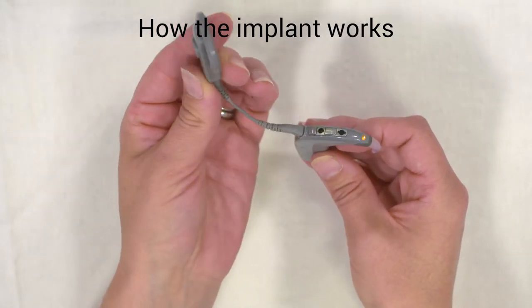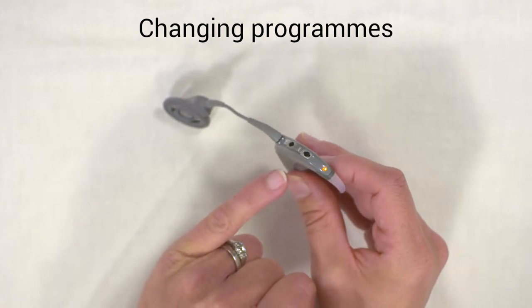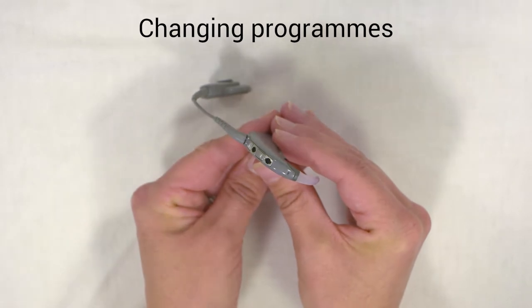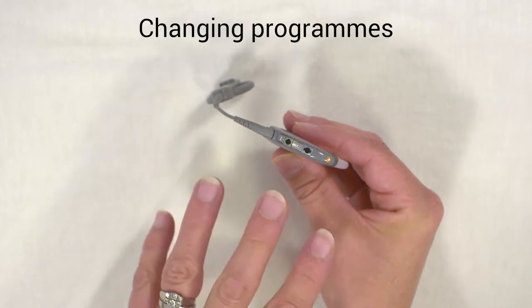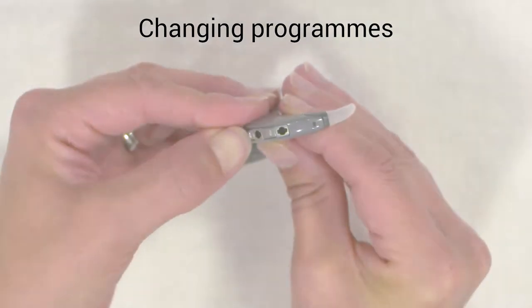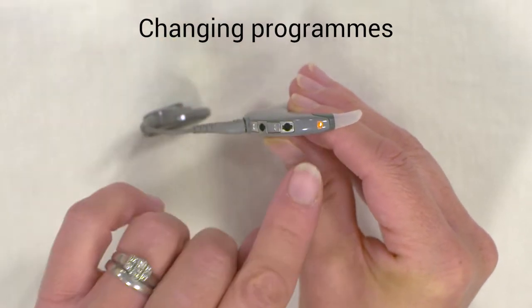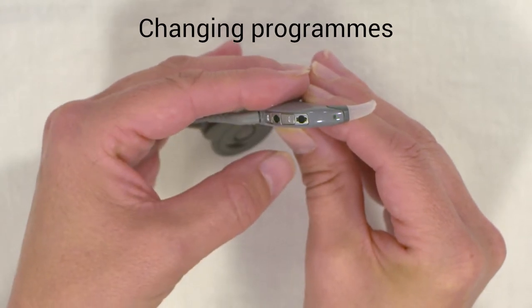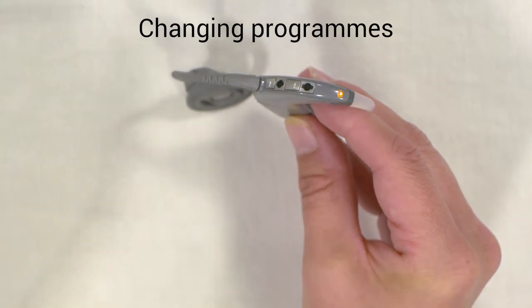Once you put the coil onto your head the orange light would stop flashing. A green flash denotes the program you're on. One green flash means the processor is on program one. The audiologist will set up the number of programs at your appointments and tell you what each program does. A short press on the on/off switch changes the program — two green flashes means it's on program two. The Nucleus 6 has up to four programs and cycles through one, two, three, four, and back to one again.